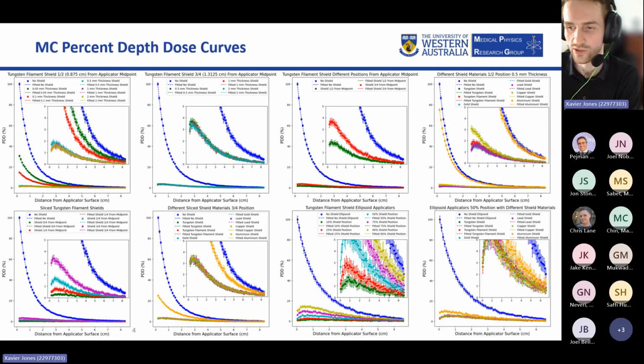An inset plot is included to zoom in on the last 5% PDD values. Curves are fitted to each PDD, whose R-squared values are all very close to 1, indicating strong fits. Error bars are displayed, with most maximum errors being below 1%.